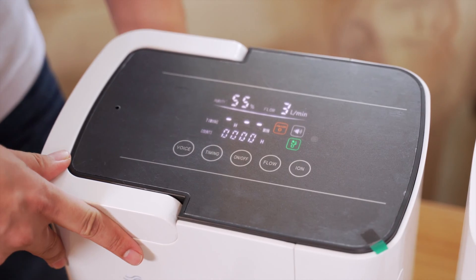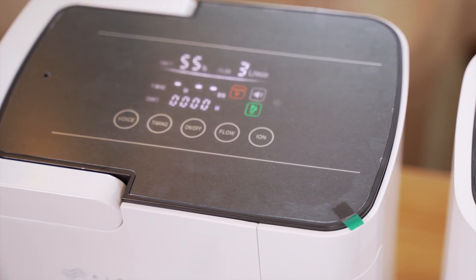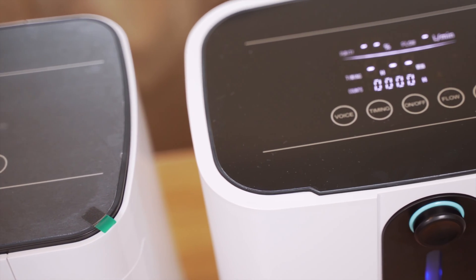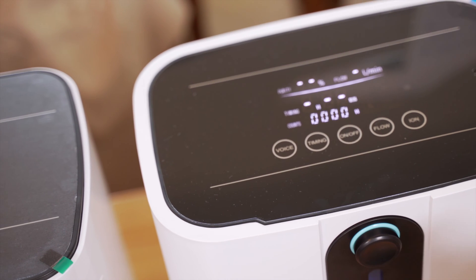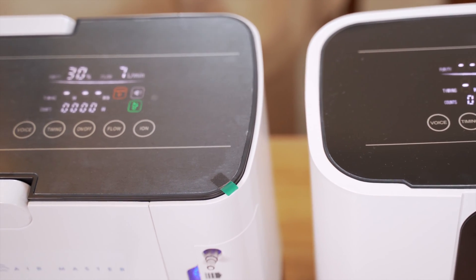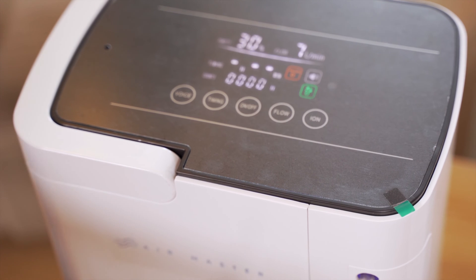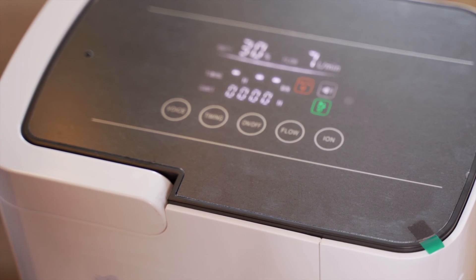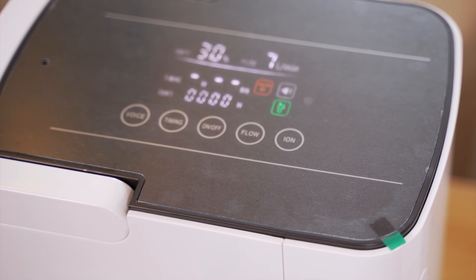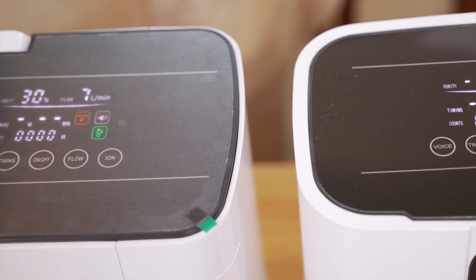Can you explain how the oxygen concentrator works? The air we breathe is composed of 79% nitrogen and 21% oxygen. The oxygen concentrator consists of a compressor and two zeolite filter beds. The compressor squeezes atmospheric air and adjusts the pressure at which it is delivered. The zeolite beds separate the nitrogen, so the oxygen is released into a tank connected to the cannula attached to the patient, while the separated nitrogen is released into the atmosphere.